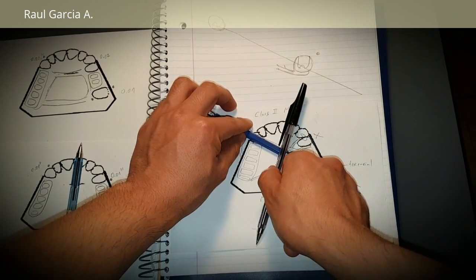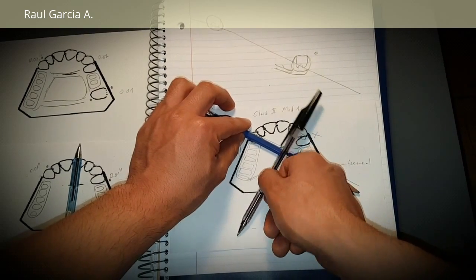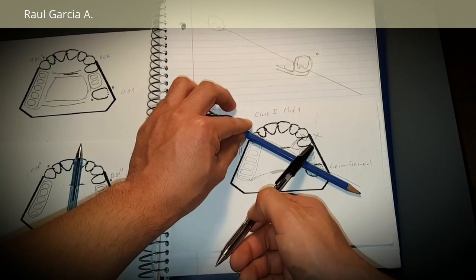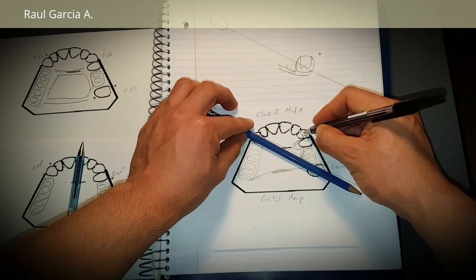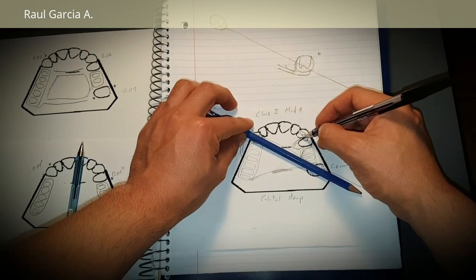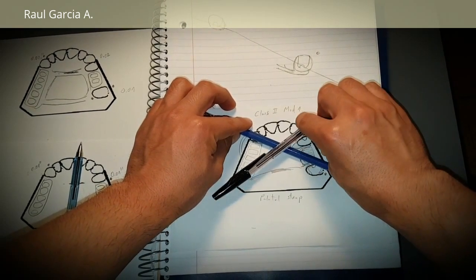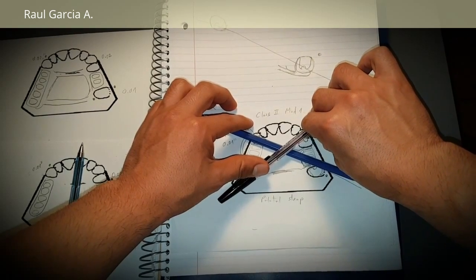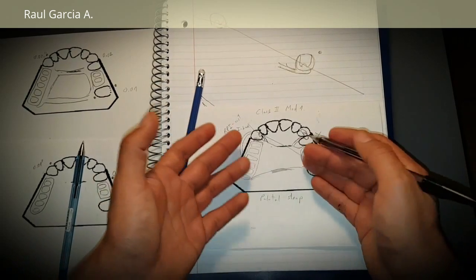So you put it here, and looking, it would be the canine, between the lateral and the canine. So you see the canine is a good abutment. That could work. And then you say, oh, but I have my premolar, so I have a guiding plane here. So I can just extend and put both my rest in the mesial fossa of the premolar and in the cingulum of the canine. Okay, now I have this. Good. My RPD is just going to be there, stable, perfect. And then you just decide on your major connector.